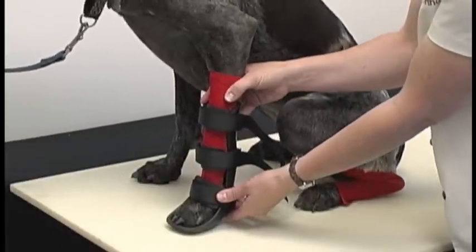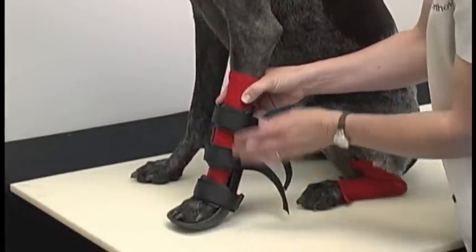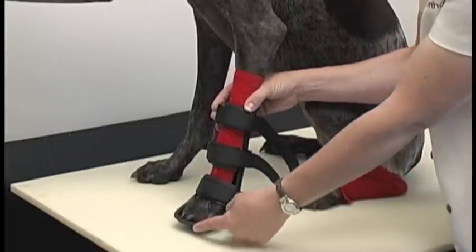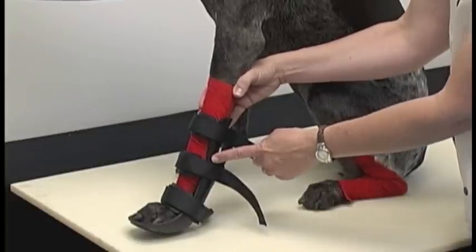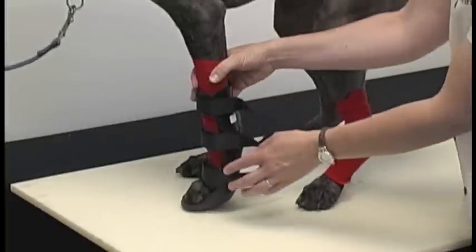We have our front limb splint on now, and I'm going to point out some factors that will show you what a good fit is. The splint extends above the wrist or the carpus. It will hit mid forearm on the dog — this means the splint is appropriate.